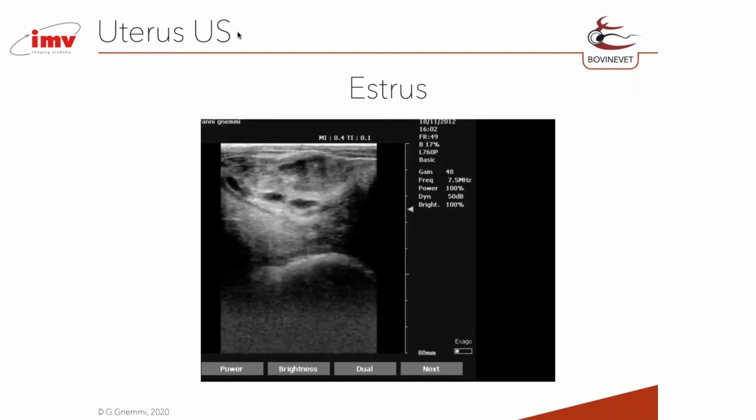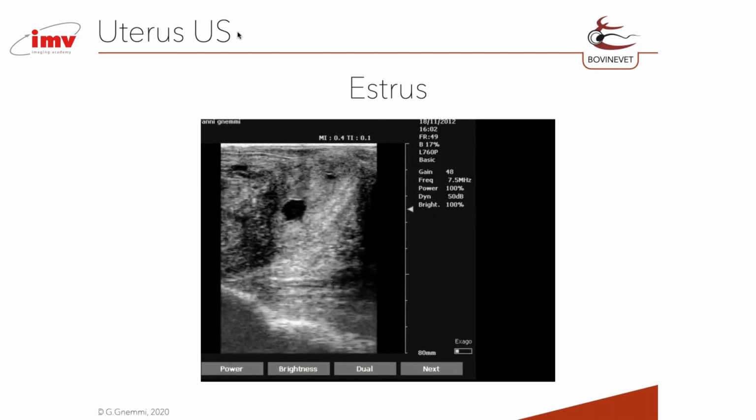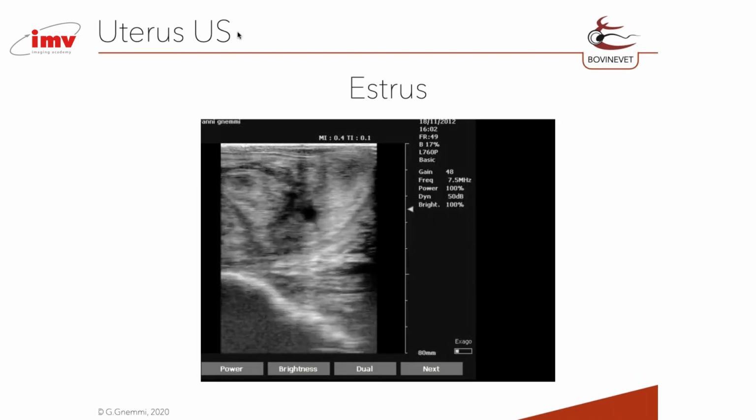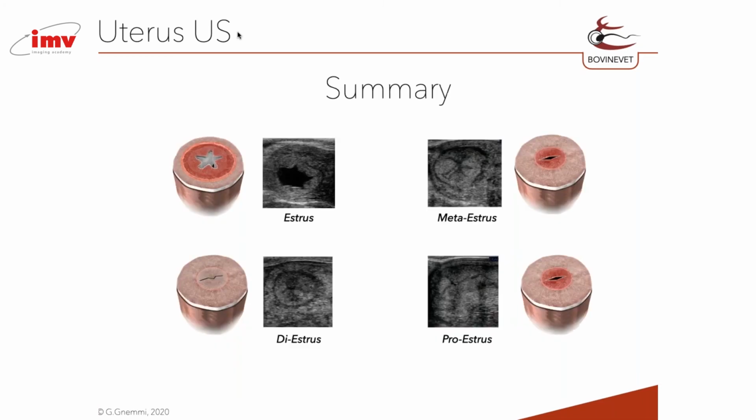And you see that the quantity of fluid inside the uterus is typical of a pregnant cow of 32, 33 days. The differences are the characteristics: the stratigraphy of the myometrium and endometrium, the different echogenicity, the presence of specular reflection, and the shape of the lumen.